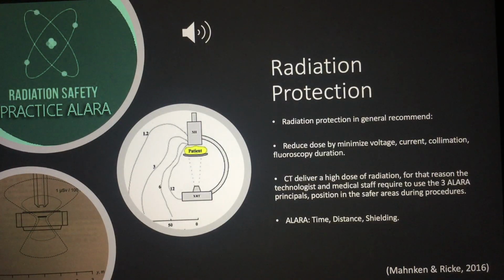Radiation protection in general is recommended. Practice the three principles of ALARA: time, shielding, and distance. Reduce patient dose by collimating, use the proper technique and the right position, stay safe, and make sure that your patient is safe.